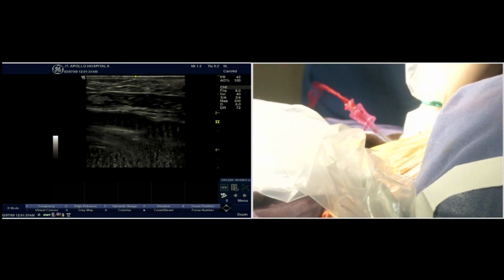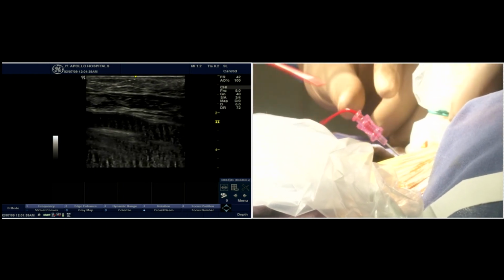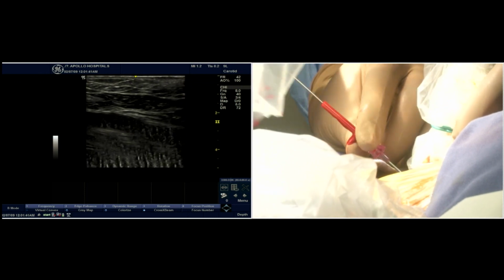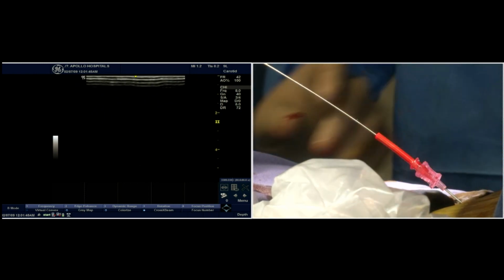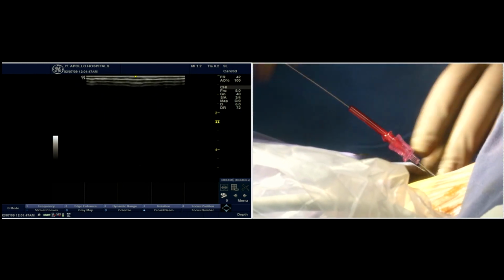You have certain slides related to the puncture at this time. They've now got the needle into it, and Thierry will be discussing that. Yeah, so maybe we can move to the next slides. On the left, you see the micropuncture technique.